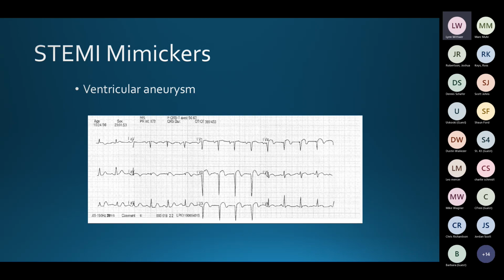Well, I'd probably want you to bring them in acutely at that point, and they need acute care. Yeah, and if you call it a STEMI, I would not be upset, because you don't have evidence. If you'd had a continuous electrocardiogram, or an electrocardiogram that showed this same pattern when he was discharged from the hospital, then you might suspect that this is an aneurysm.